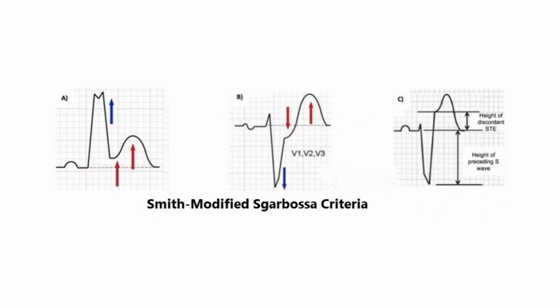It turns out that they also work pretty good in patients with pacemakers. At least they work pretty good at ruling in a ST elevation MI, not quite as good on those patients at ruling it out.